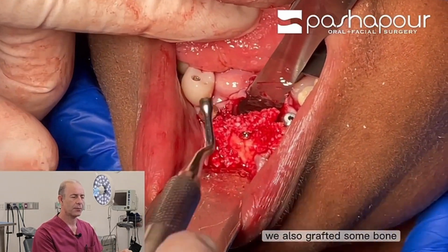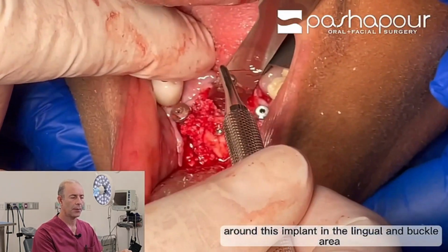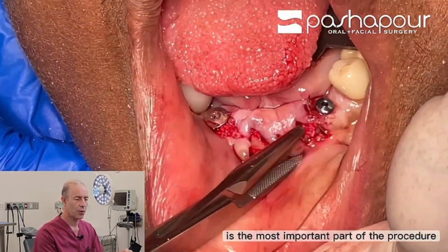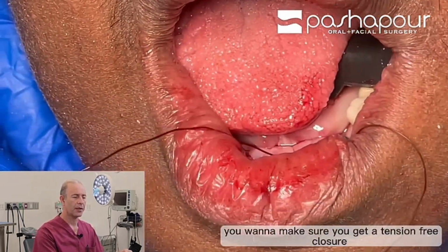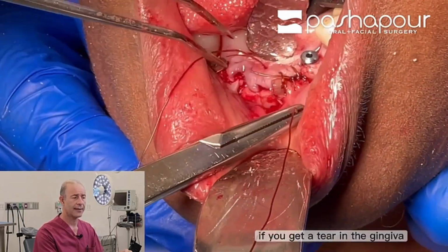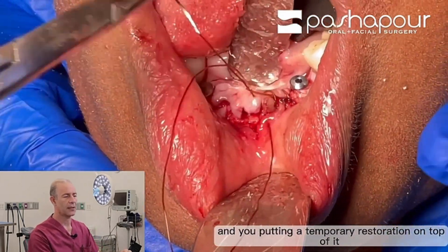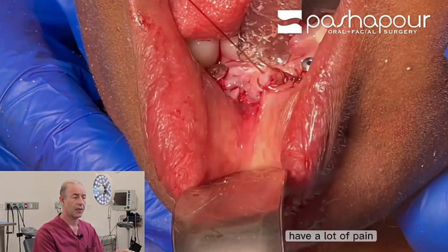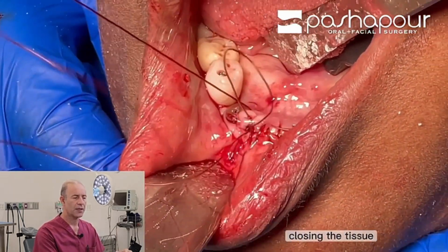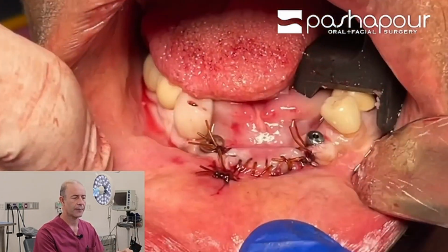We also grafted some bone around this implant in the lingual and buccal area. And here, I would say, is the most important part of the procedure. You want to make sure you get a tension-free closure with no tear. If you get a tear in the gingiva and you're putting a temporary restoration on top of it, the patient is going to complain and have a lot of pain. So we want to prevent that by doing a nice job closing the tissue without causing any laceration or tear.